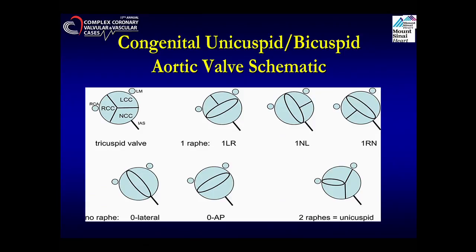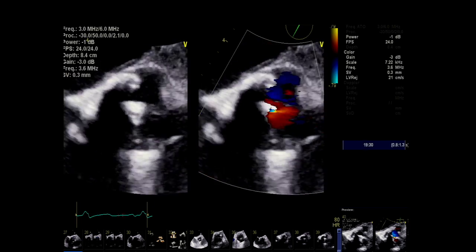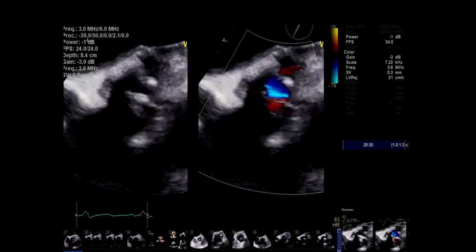Where is Partho? If you can just explain what you saw on the echocardiogram, that she had what is called a unicuspid valve rather than the tricuspid, which you see on the left upper corner. And then you see what they call the tri-leaflet and the Mercedes-Benz sign, which you normally see, which we were supposed to see in the CT scan, which we never saw. But Partho, if you can explain what this unicuspid valve is? So maybe you want to show the live echo first, and then tell us. Yeah. Good. Yes, perfect. So what you're seeing right now are the images from the transesophageal echocardiogram.